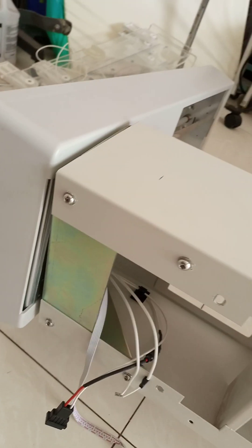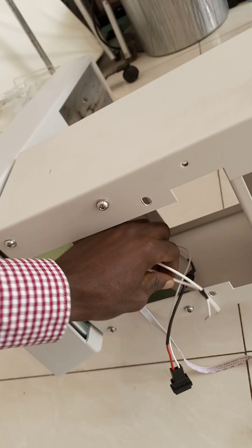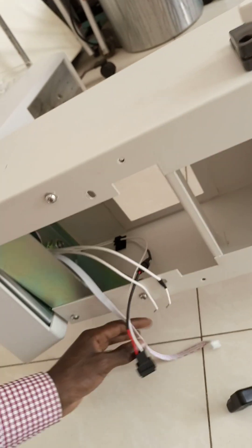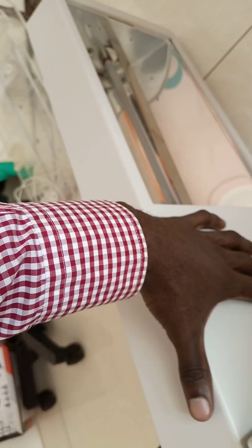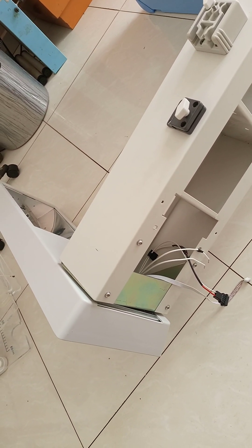I had to go into further troubleshooting — quite a lot of it. These connectors you see here connect to the heater; this one connects to the alarm, and this one to the light. After replacing the heaters and the machine still not working, I had to move on to the controls.